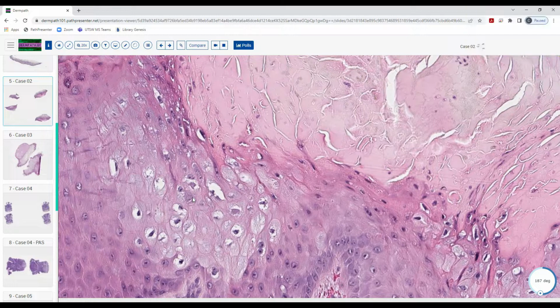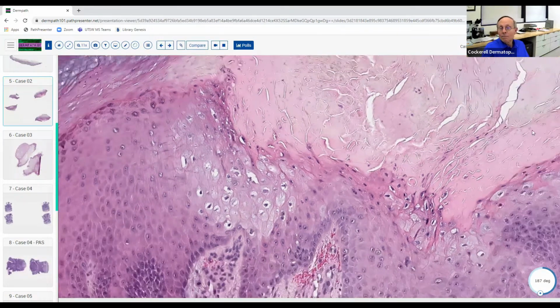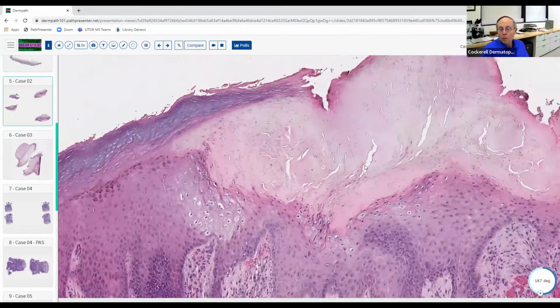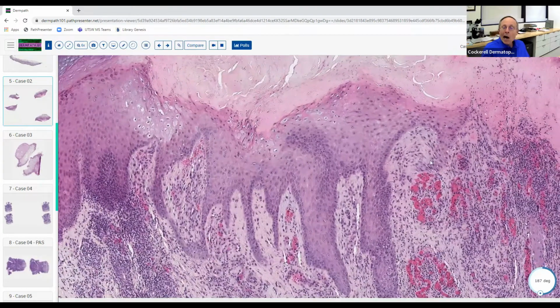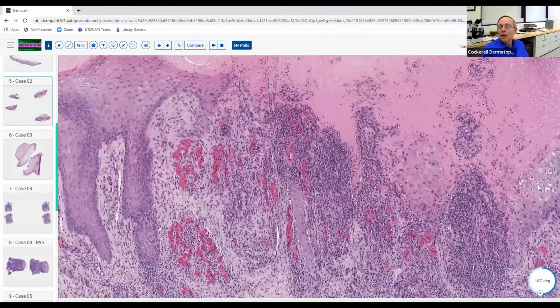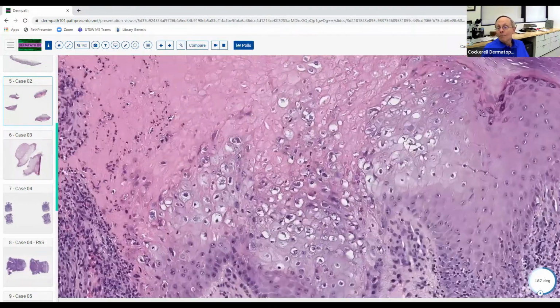Monkeypox. And if you see a biopsy of monkeypox, it's going to look very much like this. It's not going to look like herpes. It's going to have this ballooning degeneration of these large cells with this eschar. It's going to look pretty much like ORF or Milker's nodule or Yabapox or Tanapox, any of those poxviruses. They all pretty much look the same, except for molluscum.